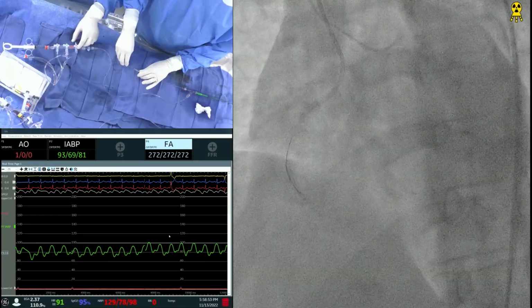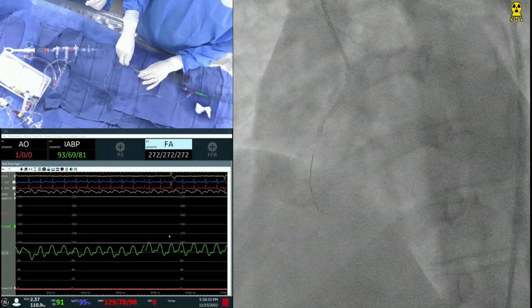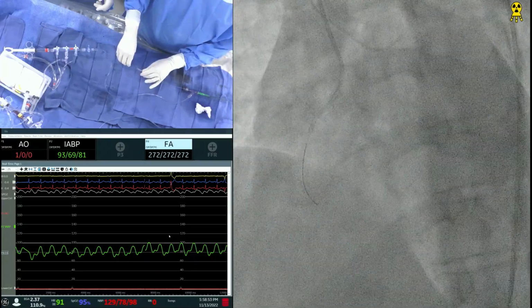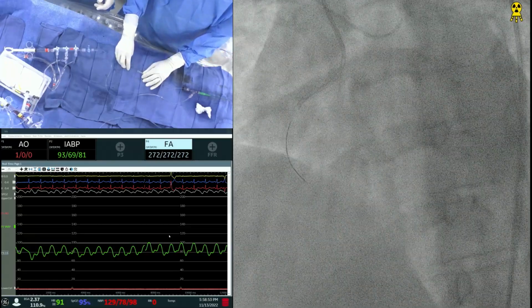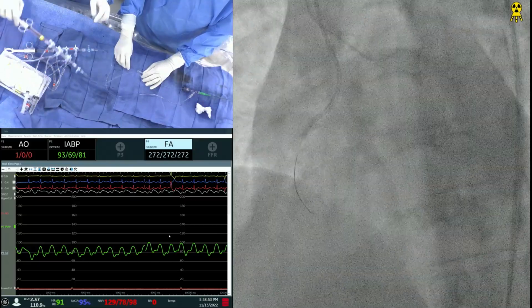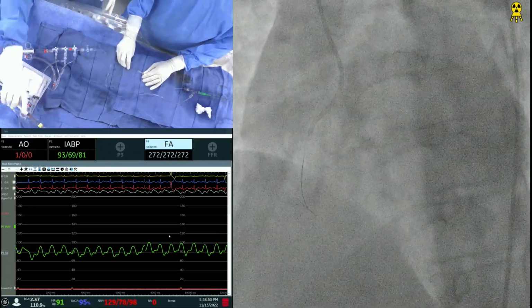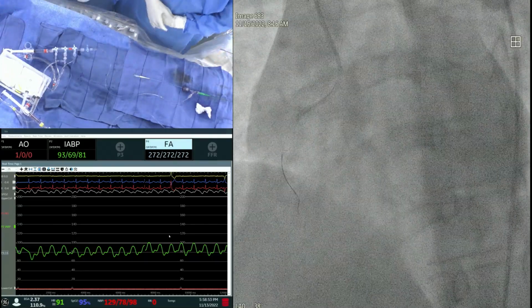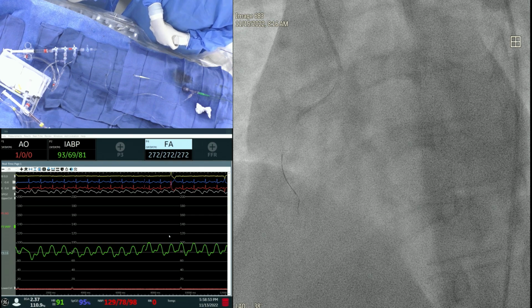So, when this patient was being discussed with the heart team and the surgeons, I'm sure he was offered a complete arterial bypass as a solution. Absolutely, that is correct. That was one of the points in this particular case: complete revascularization including arterial. In our system we have a few of our cardiac thoracic surgical colleagues who will do a total arterial revascularization, considering his age.